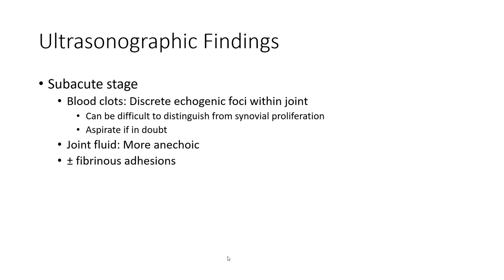In the subacute state, blood clots appear as discrete echogenic foci within the joint fluid, the joint fluid becomes more anechoic, plus or minus fibrinous strands.